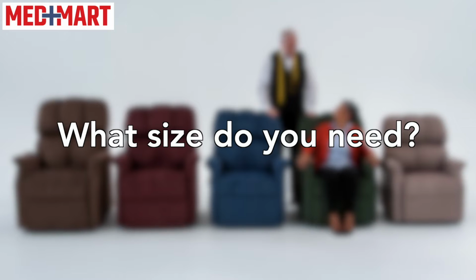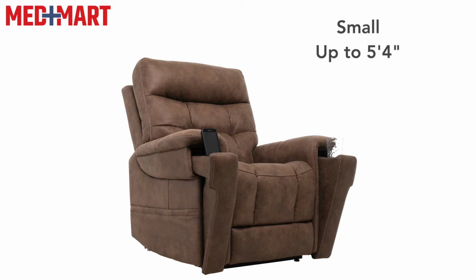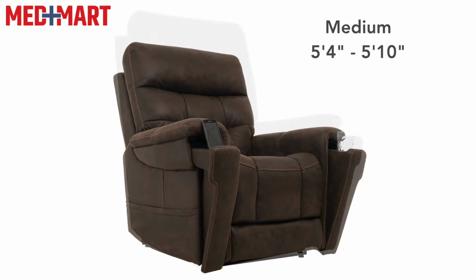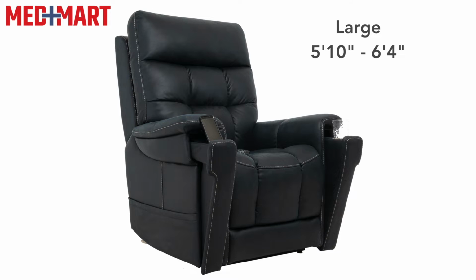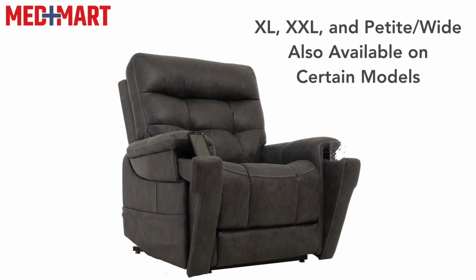Speaking of sizing, one thing we have to consider is that every chair comes in multiple different sizes. As a general rule, up to 5'4" is considered a small, 5'4" to 5'10" would be a medium, 5'10" plus would be a large. If you're someone who's on the taller side, we do have the ability to have an extra tall. If you're on the shorter side, less than 5 foot, a few of the brands we carry are considered petite small, and they may be sized well for you.